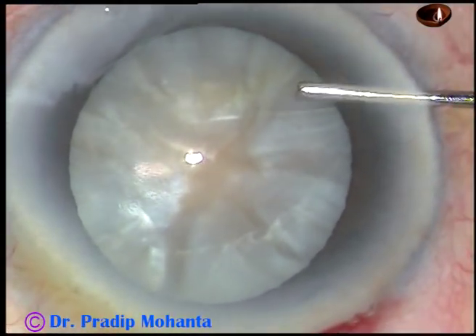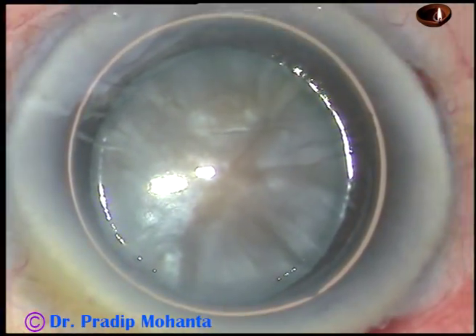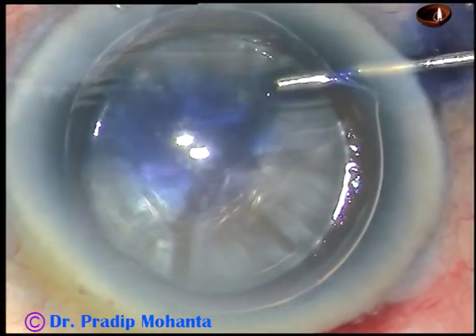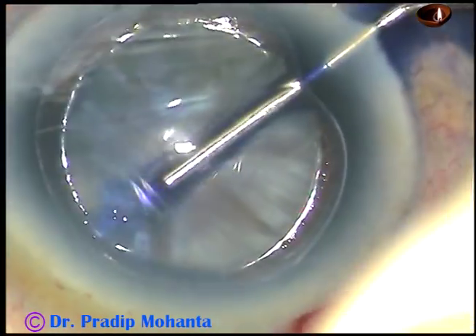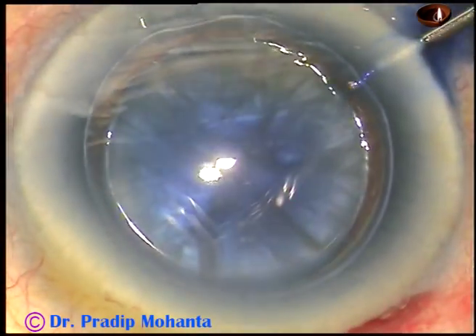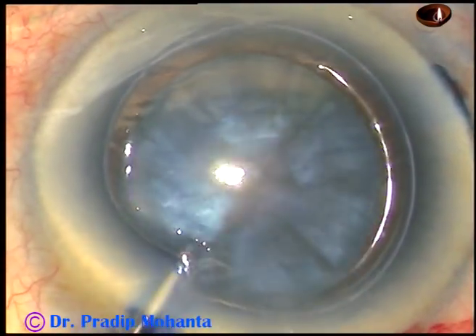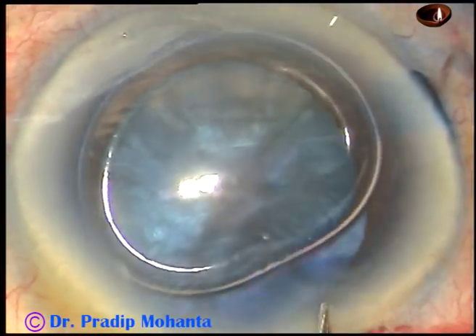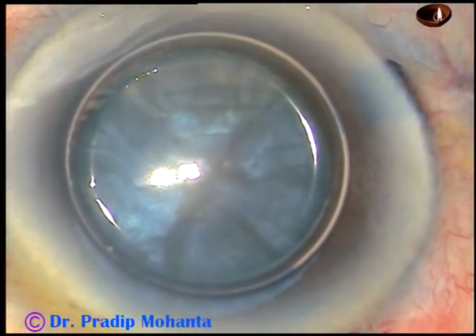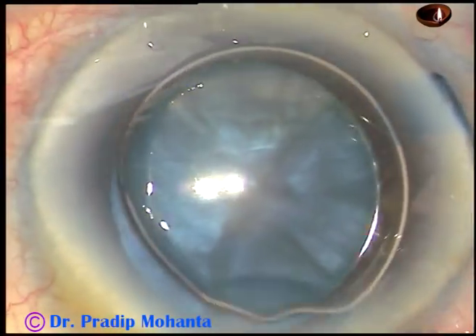Now I am going to stain the anterior capsule underneath this air bubble. Here goes the 0.06% trypan blue dye. The dye is sprayed uniformly all over the anterior capsule. Now here is a little bit of adrenaline to see if the pupil dilates a little more. And now the dye is washed out.